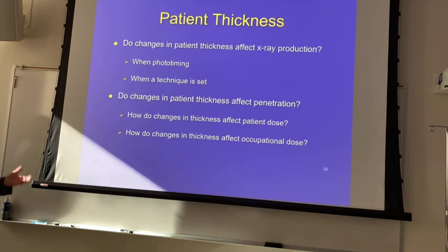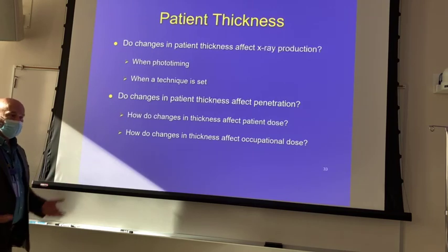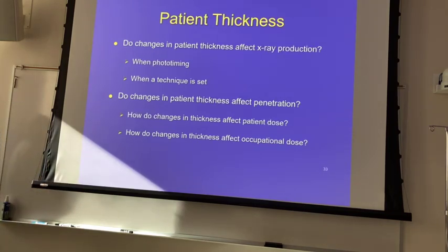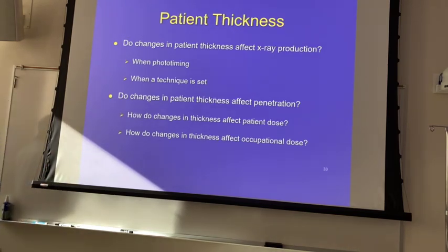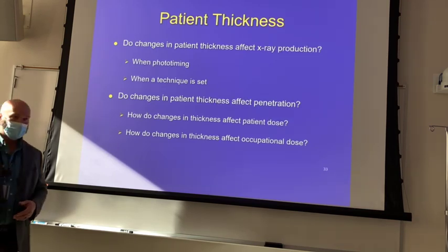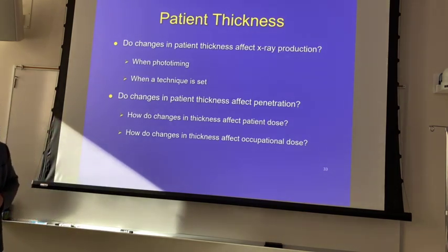So, as the patient size goes up, even in the presence of soft tissue, if we don't do anything to our technique, what's going to happen to our exposure at the image receptor? It won't be enough, right. We're going to underexpose the patient. So what do we need to change? As of right now, the literature says mAs. Again, I expect that to change in your career's time, and it'll probably make a change to kVp.